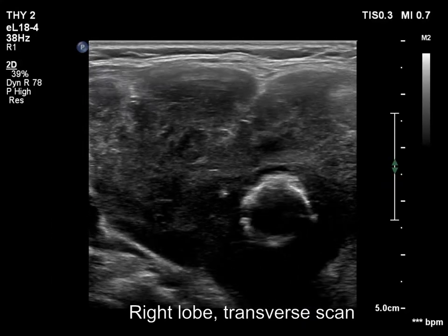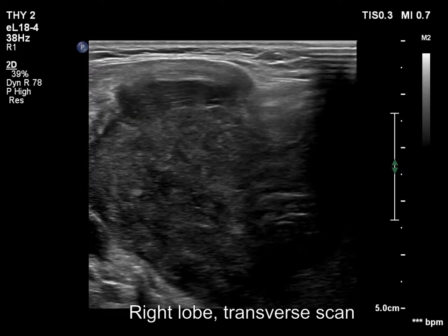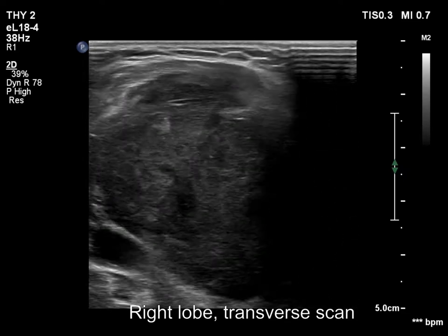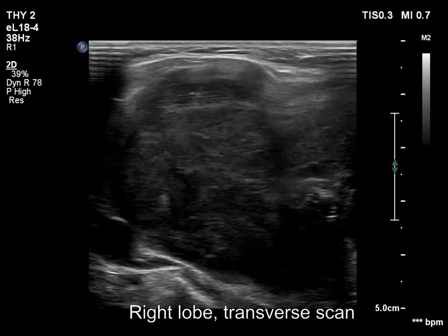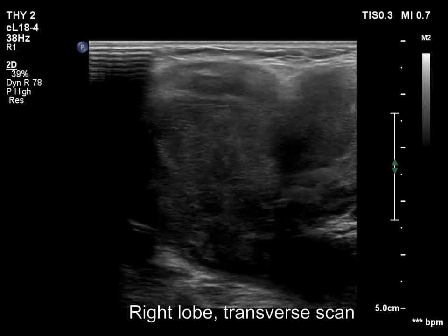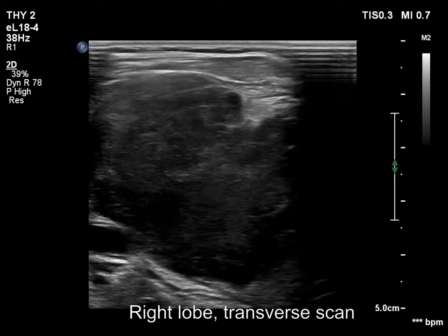The right lobe has a large, irregular hypoechoic mass. The mass has an irregular, lobulated surface.